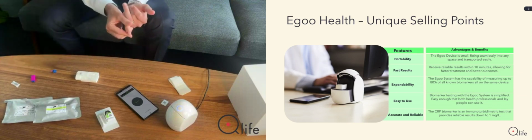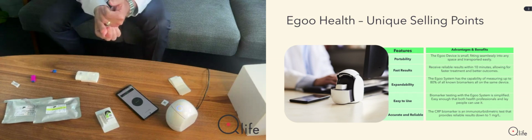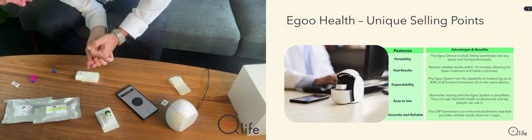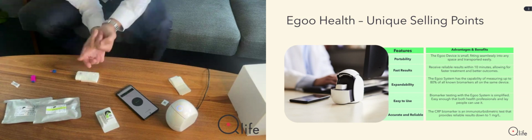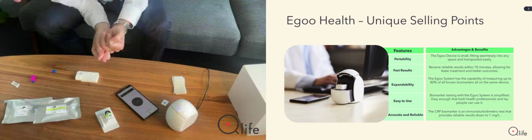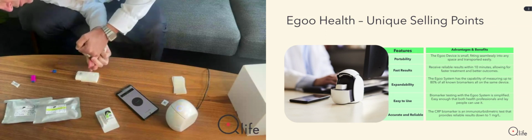The first, you can see here, you should not massage too heavily, because then you have the risk of doing hemolysis, which means that the red blood cells are broken. And so you should just do it very, very slowly and easily. And actually this one here is not so good, so I will take it away again and start over, because it would be nice to have a good sized drop of blood to deliver.